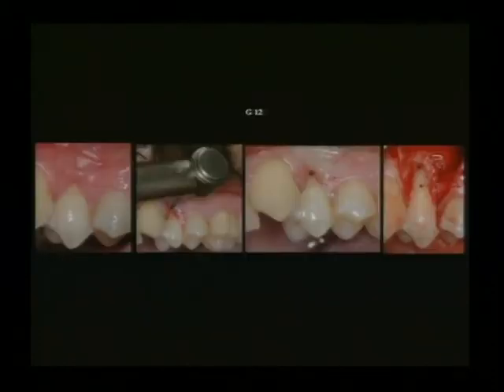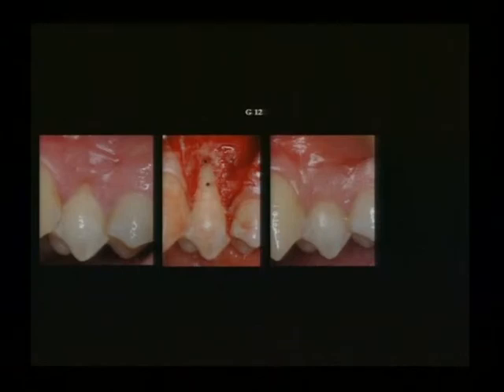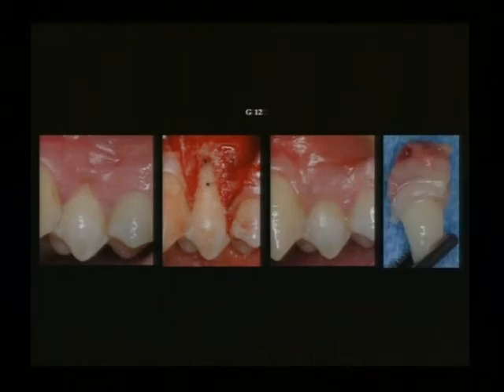Here's one of my patients. This is our recession defect. I'm marking it at the free gingival margin with a high-speed finishing burr so we can see that histologically. That's that little mark. We now have our full thickness flap here. I'm marking it at the osseous crest again. Here is 9 months after the graft, we have 100% root coverage, and we remove the tooth en bloc.